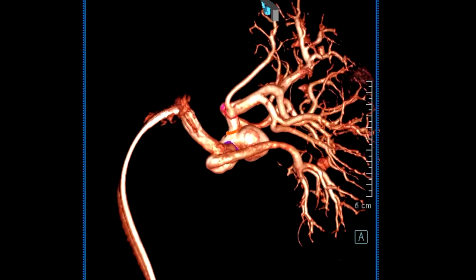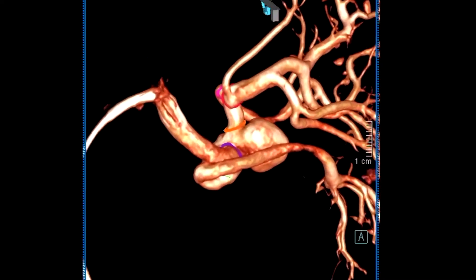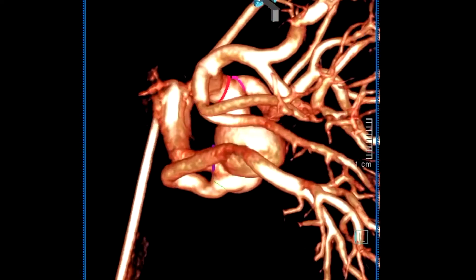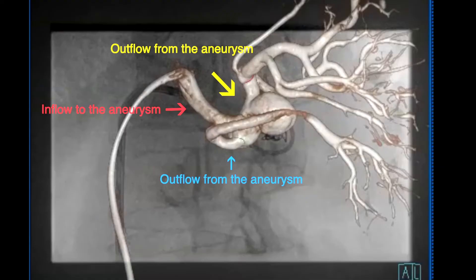Shown here is the 3D reconstruction made possible secondary to the rotational angiogram. This 3D reconstructed image shows inflow to the aneurysm via the mid renal artery and two outflow branches. Highlighted in blue is the branch that supplies the lower third of the kidney, and highlighted in yellow is the outflow branch that further divides into two branches supplying the upper two-thirds of the kidney.